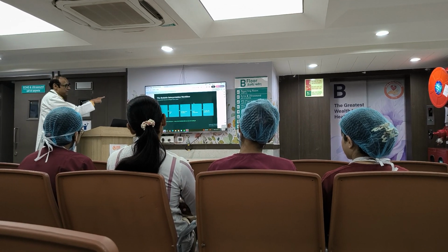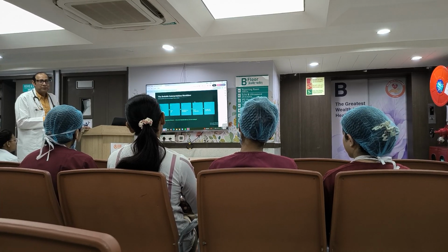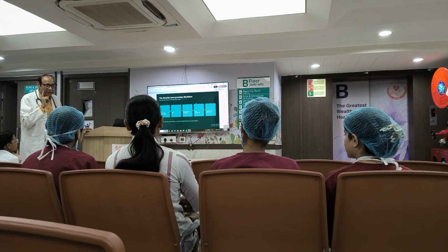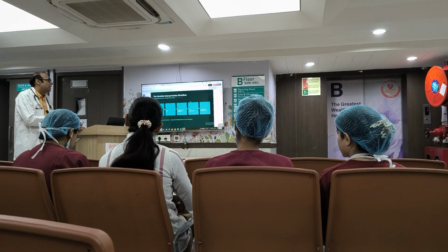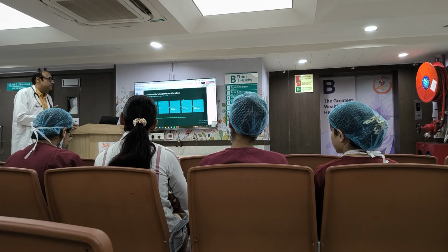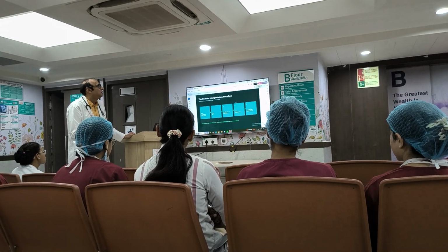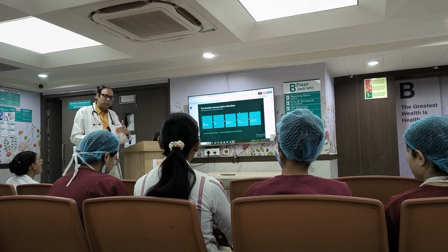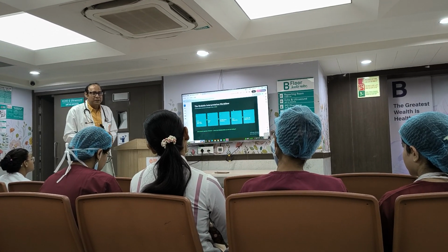Okay, any doubt with this flow chart you people are following in your clinical practice? Okay, I will repeat it. Check oxygenation, read pH, identify primary disturbance, check whether compensation is there or not, and then correlate with the patient. ये जो रिपोर्ट है मैच कर रहा है कि नहीं, then you inform the doctor and concerned person, who is a physician or clinical associate.